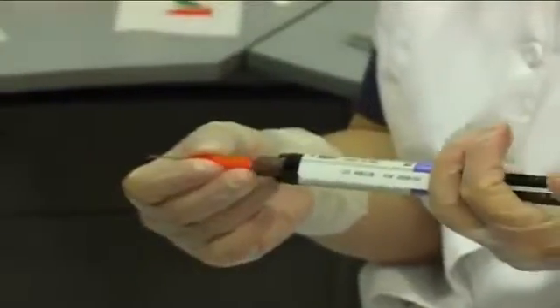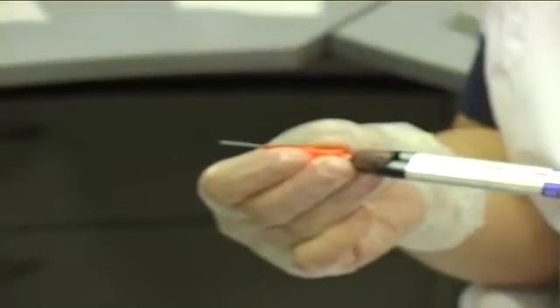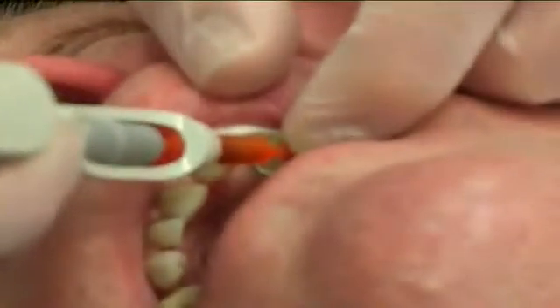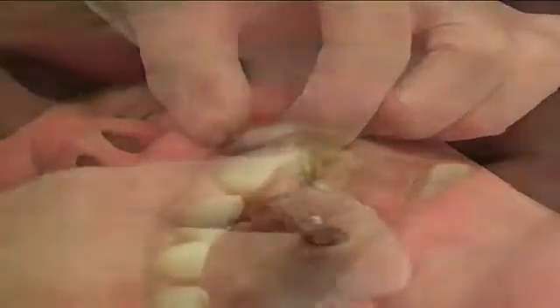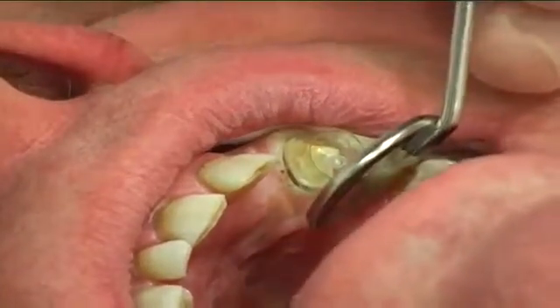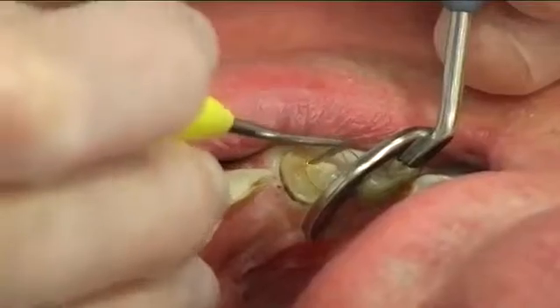The canal was filled with dual-cure cement as instructed by the manufacturer, by filling the canal from the bottom and proceeding slowly by moving the syringe steadily upwards until the canal was filled. The post was inserted into the root canal. Excess cement was removed and the cement was light cured.